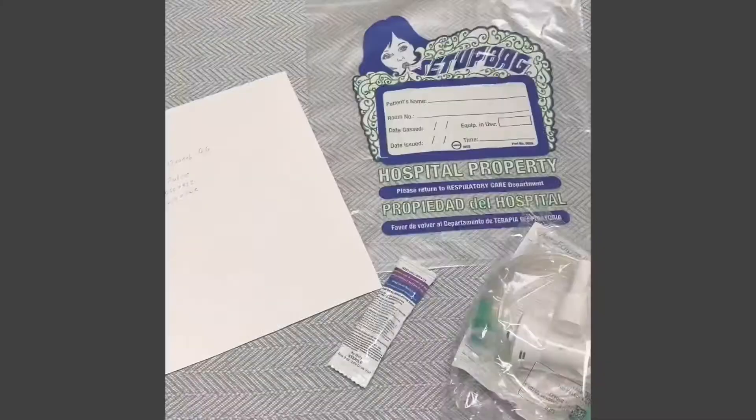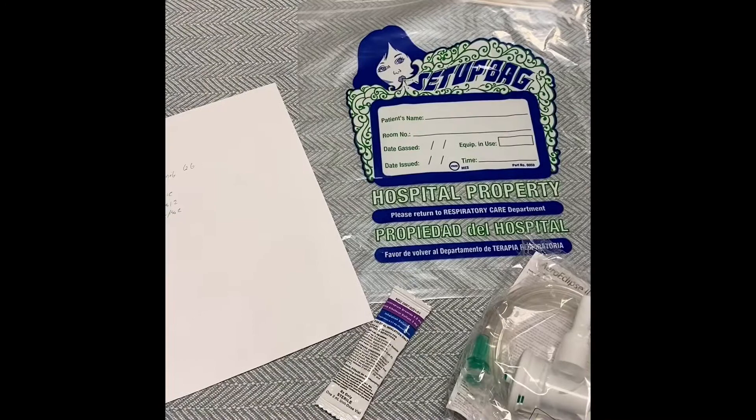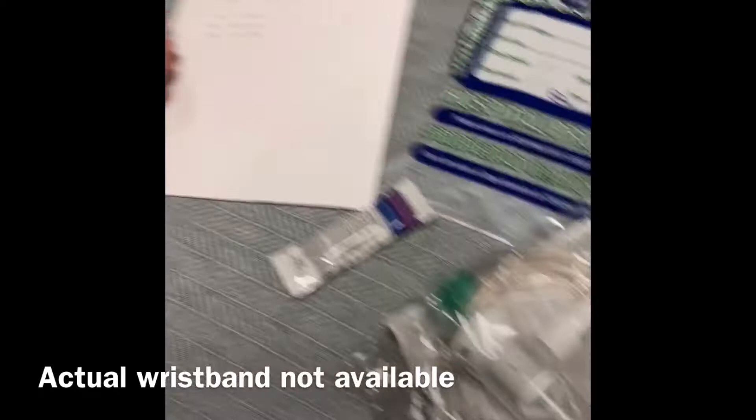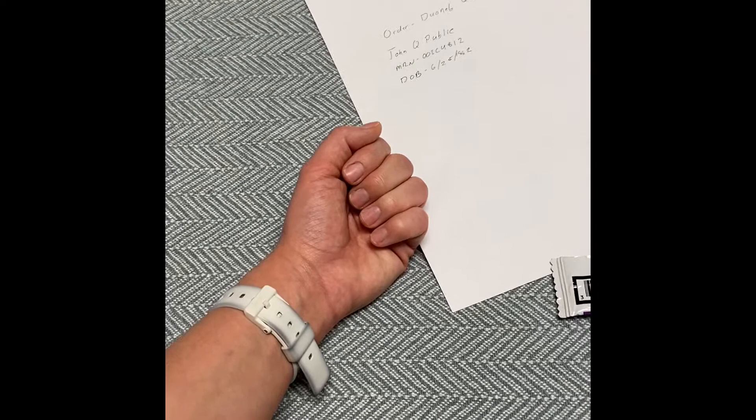So now that you have your order, medication, and equipment, it's time to go meet your patient. Verify you have the correct patient by looking at their wristband and verifying their name and date of birth. Before giving the treatment, you want to scan the patient's wristband and the medication.